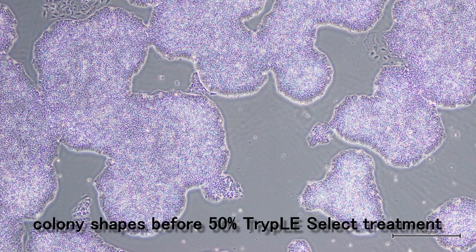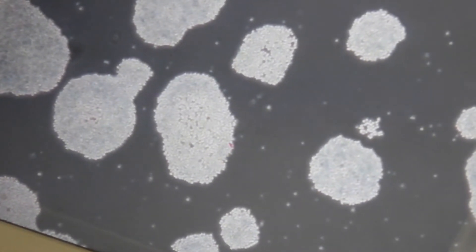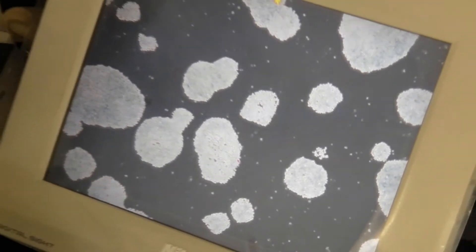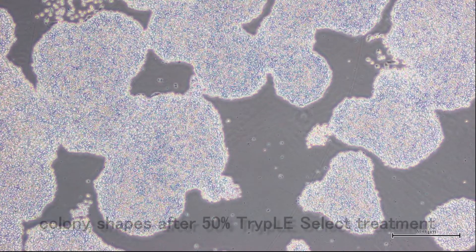After reacting for an additional 3 minutes, for a total of 4 minutes, take the 6-well plate from the incubator and observe the cells under a microscope. Check that cell-cell adhesion has weakened and that each cell is rounded. Normally, 4 minutes does not decompose adhesion between iPS cells and the coated matrix, so cells remain attached to the well surface. If cells still adhere tightly after 4 minutes, return the plate to the incubator and check every minute until each cell is rounded.